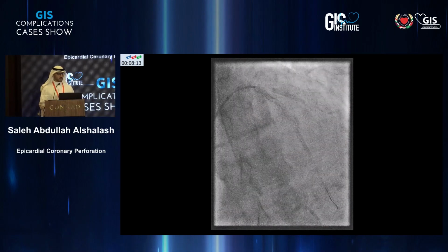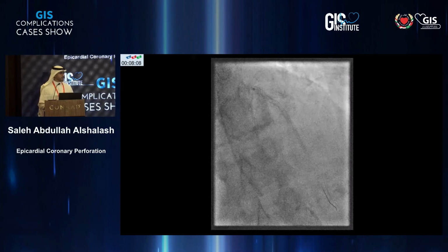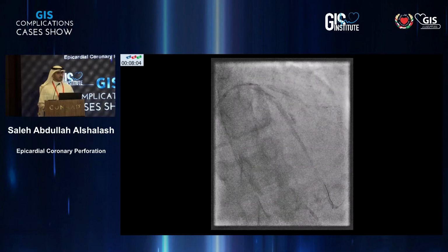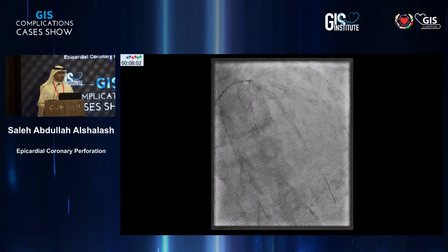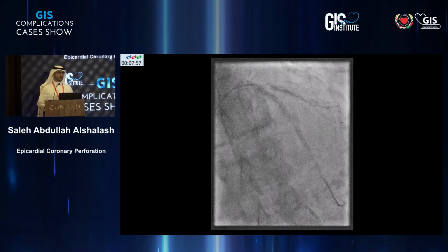So here we saw this, everyone in the room panicked. I know everyone says stay calm, but we were not calm. The nurse was panicking, I was panicking, everyone was panicking, except the patient. We called for an echo, we called for another doctor, additional nurse, mixed inotropes, started IV fluids.